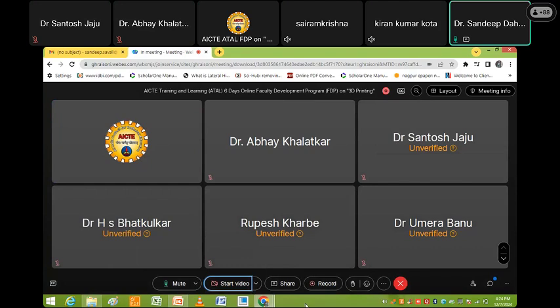But in standard implants, from different branded companies like Indus, Johnson, Stryker, they have all standard implants. In that case, they actually perform experiments on their implant, and based on this data, they have developed their implant. But in the custom implant, it is not always possible. So in this case, finite element analysis is the only solution.